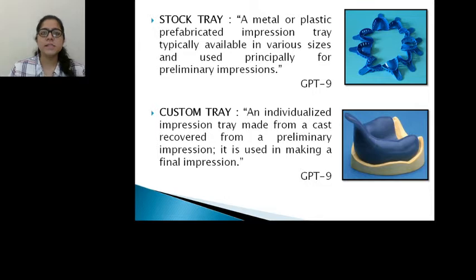A stock tray is defined as a metal or plastic prefabricated impression tray, typically available in various sizes and used principally for preliminary impressions. A custom tray is defined as an individualized impression tray made from a cast recovered from a preliminary impression. It is used in making a final impression.